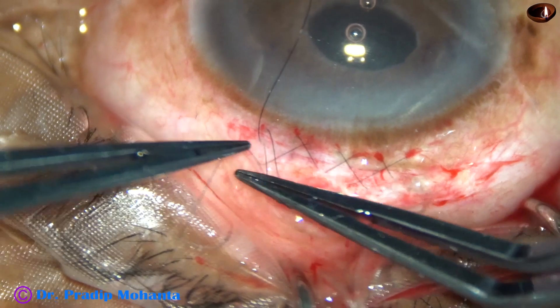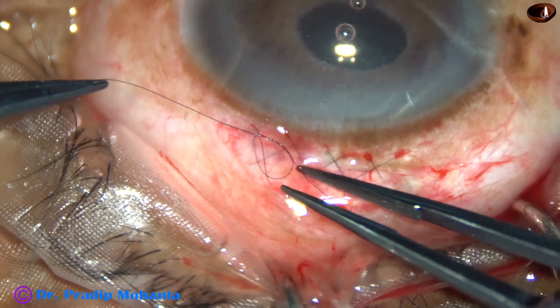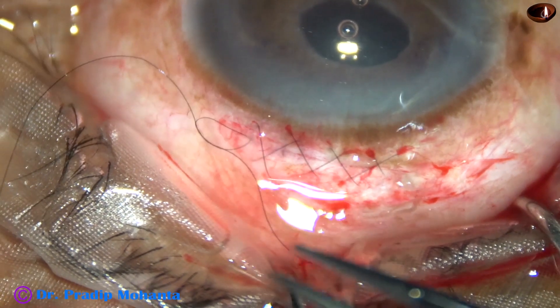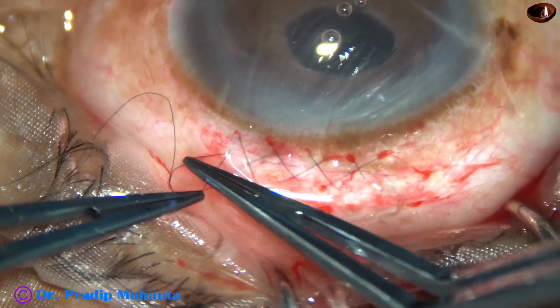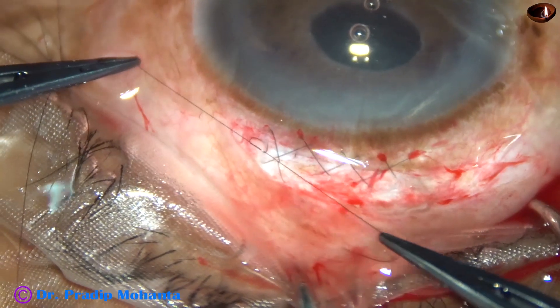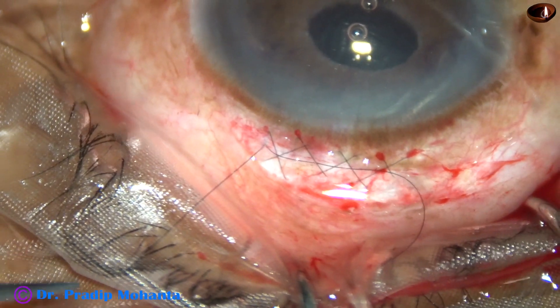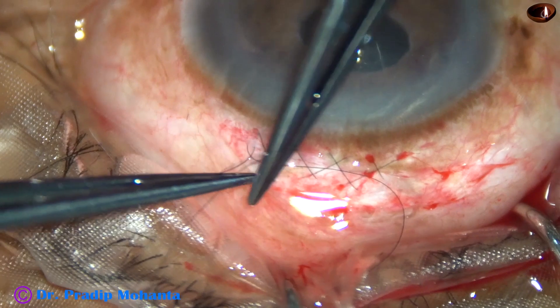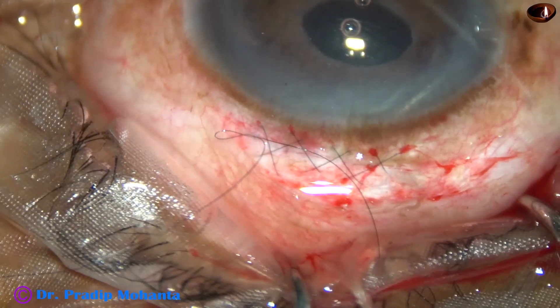I'm going to put this as two throws. I'm not going to make the final knot now because I may have to open this wound if necessary. So I just keep the suture this way at this moment.